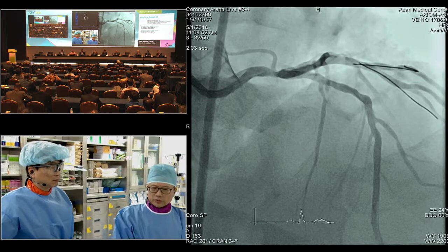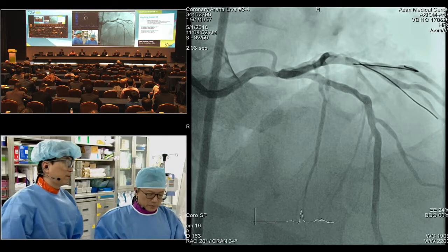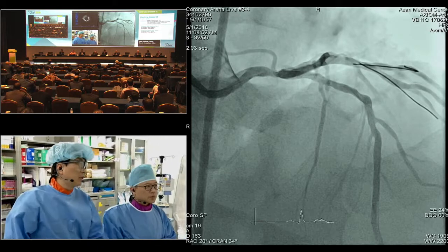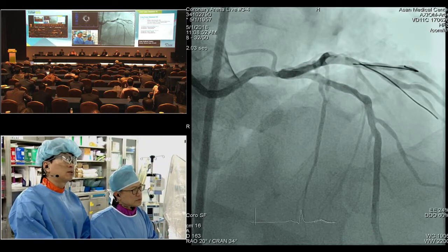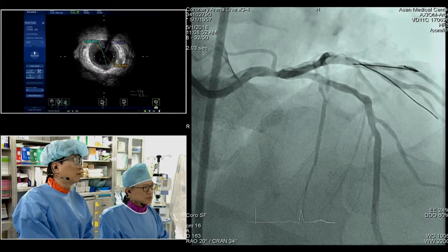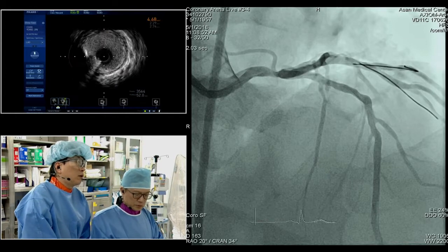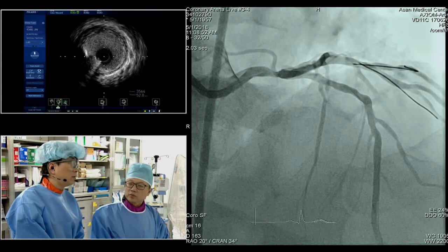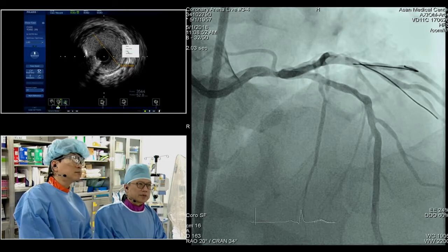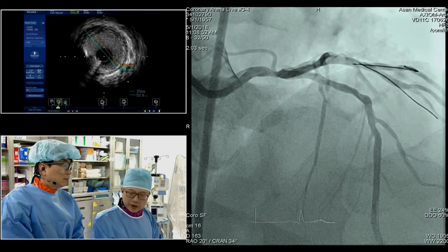Okay, so I think it's the stent size. We thought maybe, Dr. Lee? 3.5. The minimum lumen at the distal landing zone just beyond the septal point, the vessel size is around 3.5, lumen is 3.0, and proximally the left main size is 4.3. However, lumen size is 4.3. So we want to choose the 3.5 to minimize the damage of the distal landing zone. Right, and we could use a Synergy stent. We can always make it bigger, close to 4.75. So I think we can do that.